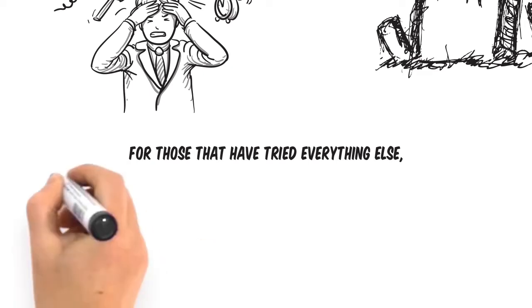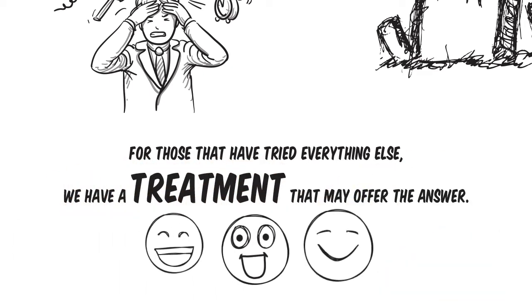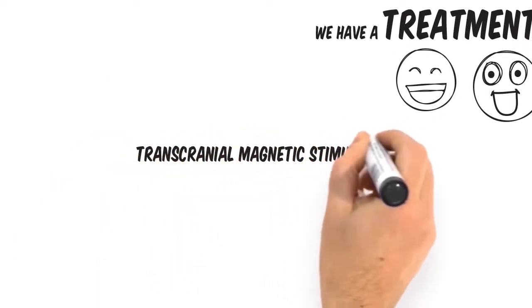For those that have tried everything else, we have a treatment that may offer the answer. Transcranial magnetic stimulation.